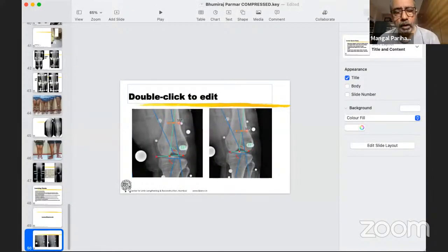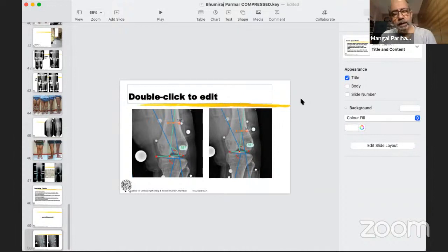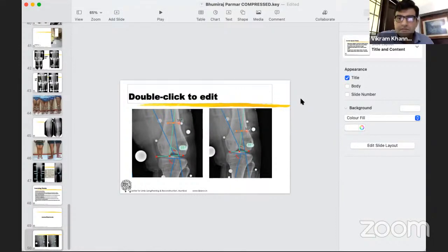Great. So on the right side, did you do a rotational deformity correction or not? So we did it in the distal osteotomy site acutely. Okay. So it was done, and there was no additional rotational correction. No, sir. On the right side. No, sir. Okay.